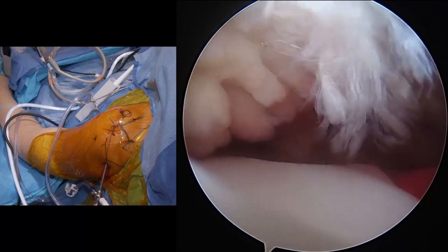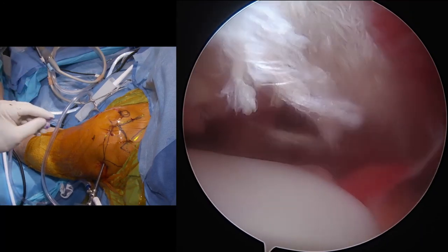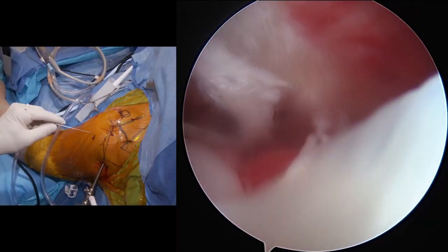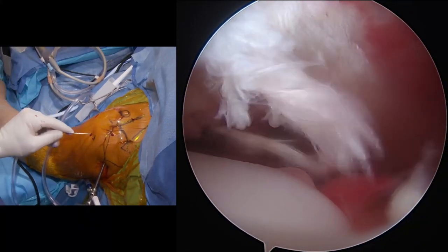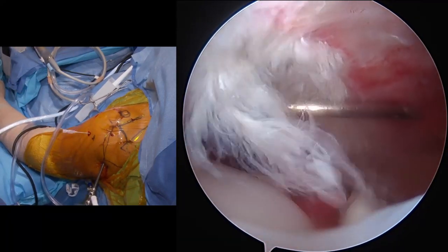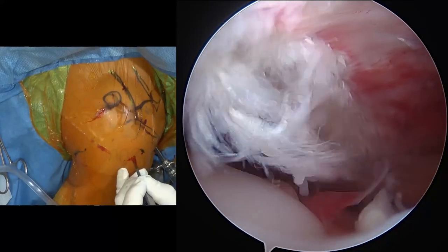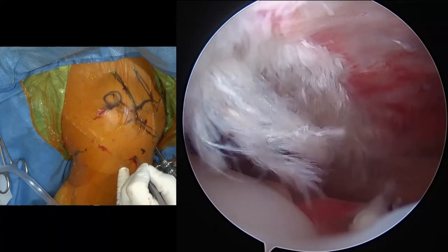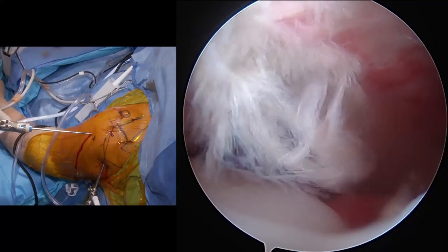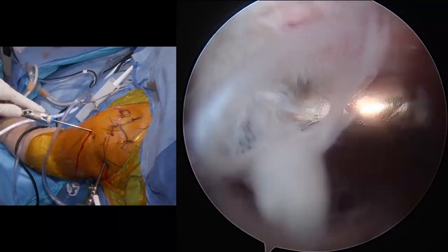Yeah, 18 gauge needle. Knife, please. All right, we'll go ahead and establish our lateral portal for the subacromial space, and we'll start to use our shaver to make some room here. We see some significant fraying in the lateral edge of the acromion. Get this all cleaned up so we can take a close look at what we've got in the subacromial space.